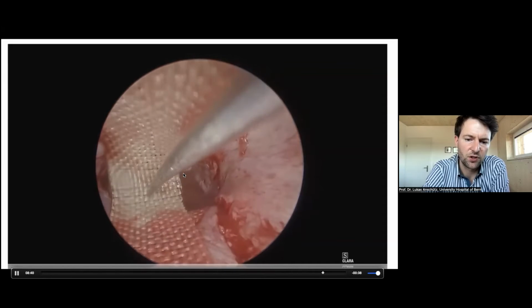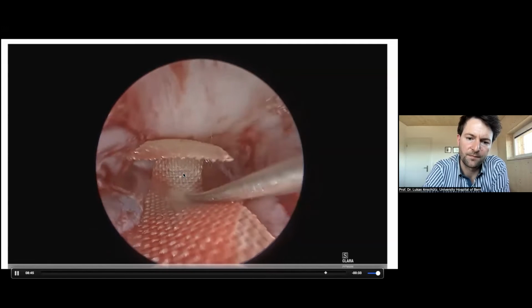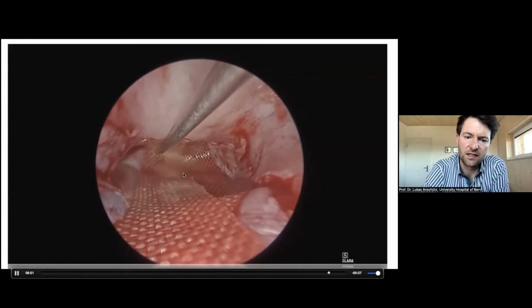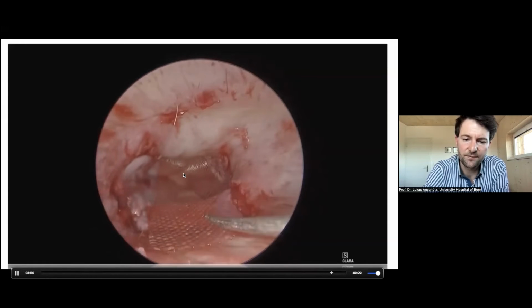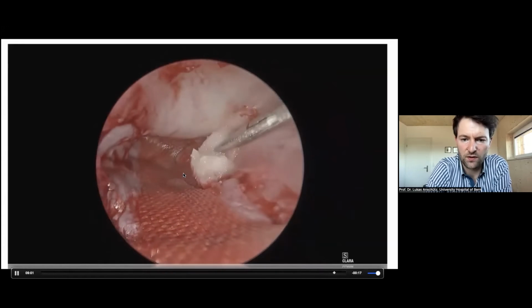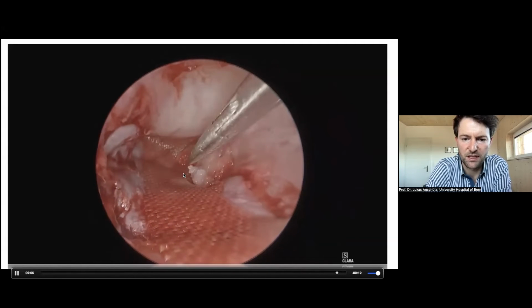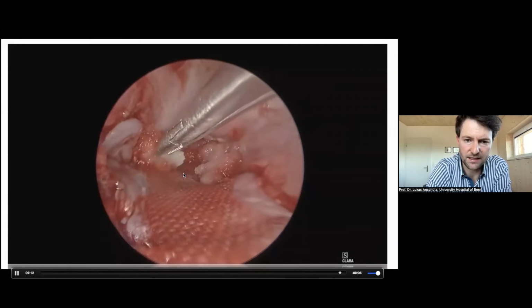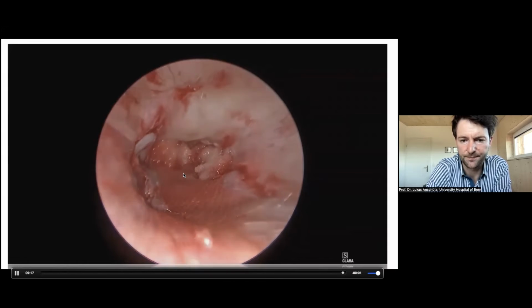And in Bern, we used to put some silk inside to make the dressing of the external auditory canal, some silk, and then a little bit of gel foam inside. The silk is quite nice because it is not sticky. So after 2 weeks, when I remove the dressing, the patient feels almost nothing, and we have good results. We use this in Bern for many years now, and this is a nice technique to have the canal in a good shape after 2 weeks of healing.